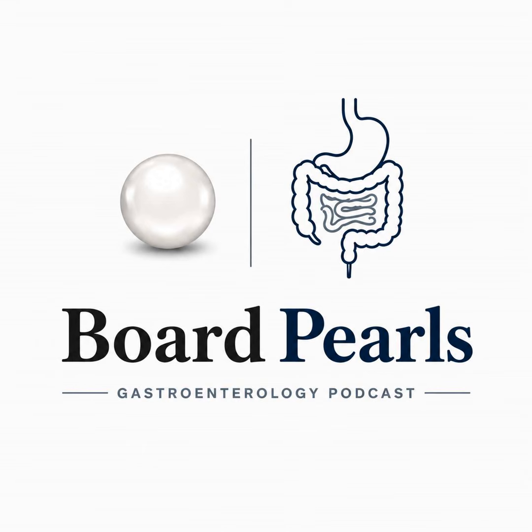The way the system addresses retention risk in advance is the Patency capsule, the Agile Patency capsule specifically. It is a self-dissolving dummy. The patient swallows it before the diagnostic capsule. The Patency capsule has a barium core surrounded by a lactose and barium body that dissolves over about 30 hours. It contains a small radiofrequency identification tag that can be tracked externally or imaged on plain film.